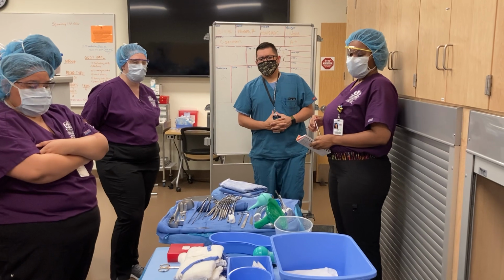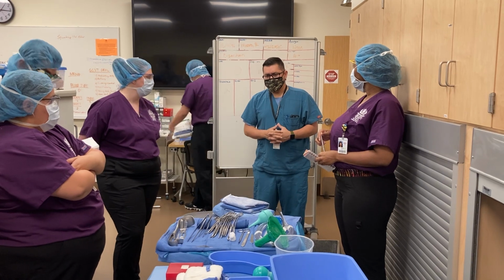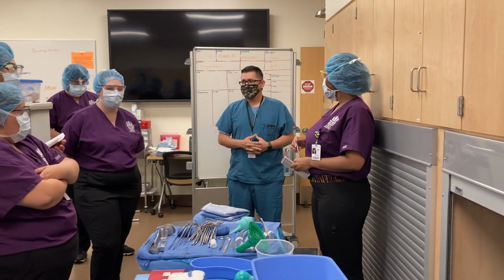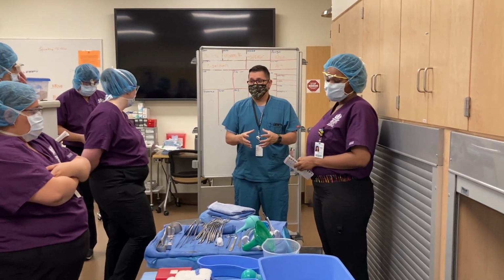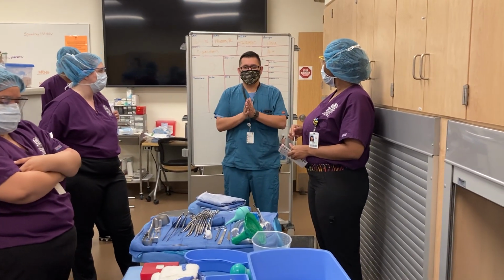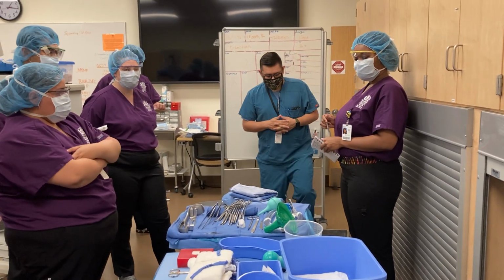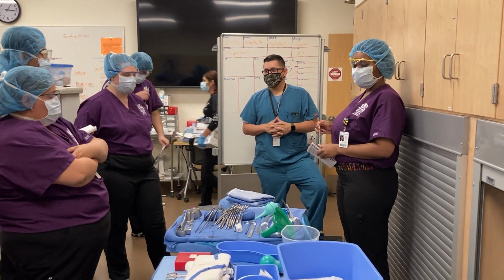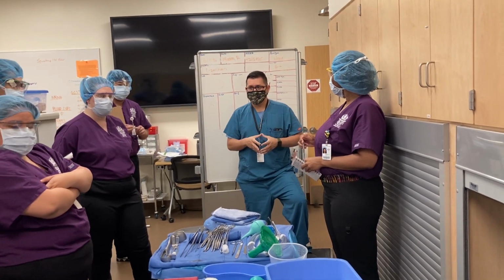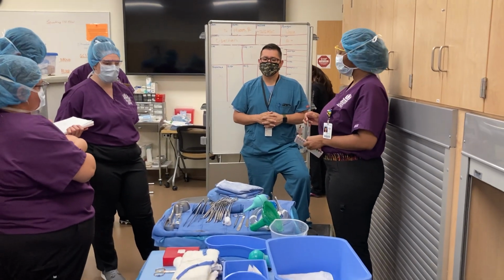Definitely. All right, and other things, again, simple retractors and instruments that you might not have here. Will you have an O'Sullivan-O'Connor here? The answer is no. Again, that's one size, and the baby can be many sizes. Okay, let's try to fit the baby through this. No, right? Not enough lube is going to help it. So that is a GYN instrument. Okay? Remember, we're doing OB. So this specialty is OB, obstetrics, being the C-section. This is why I wanted to specialize this for you guys, so you have a better understanding.